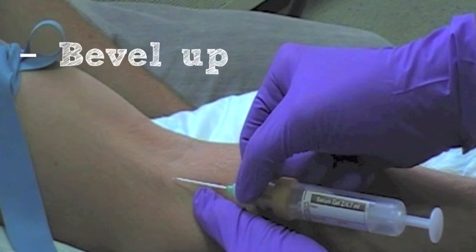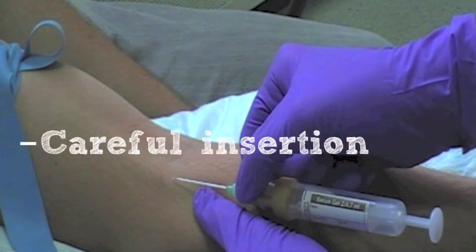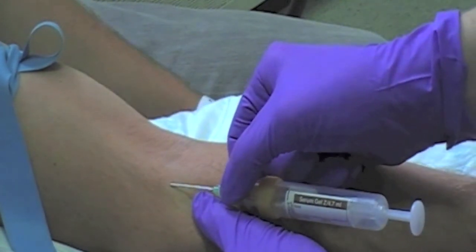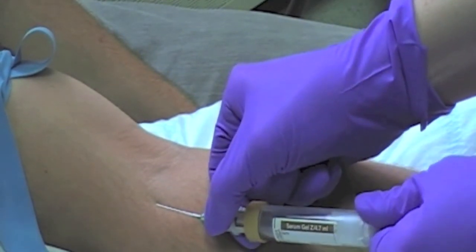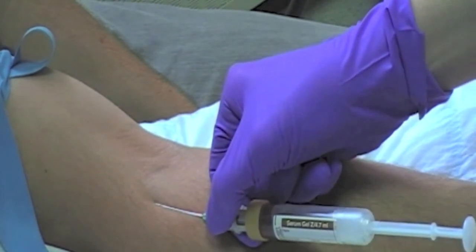Advance the needle, bevel up, into the vein at an angle of approximately 30 degrees. Care should be taken not to insert the needle so far that it continues through the vein and out the other side. Once the needle has punctured the vein, you can release the traction on the patient's arm. You must not let go of the needle hub at any point, holding it securely between your thumb and index finger. Fully withdraw the plunger, allowing the bottle to fill with blood.